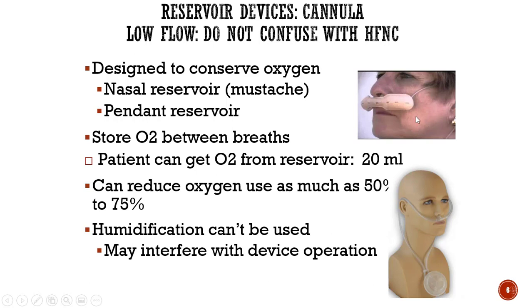This is low flow. The reason you can't use humidity with these is because there's a tiny little membrane in here and a membrane in here that works so that when you inhale, it opens and it lets that extra oxygen that's been collected flow into your nose. And then when you exhale, that membrane closes back down to trap the 100% oxygen and begin to refill it.